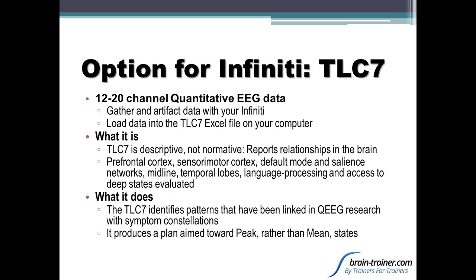But after you've identified the patterns, the TLC then produces a plan which you can implement to train the client's brain toward the peak based on a custom view of where his brain is right now, what patterns are there, rather than looking at just means.